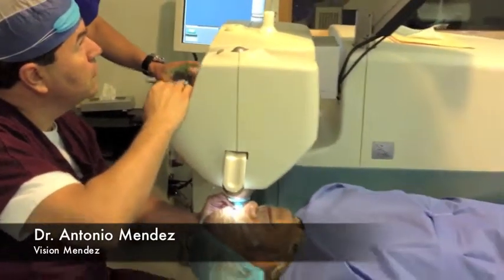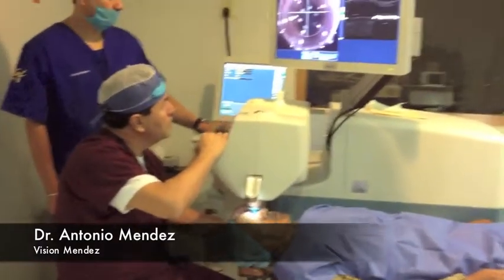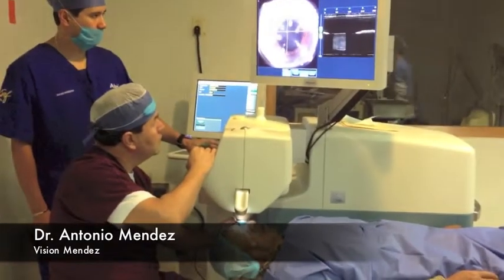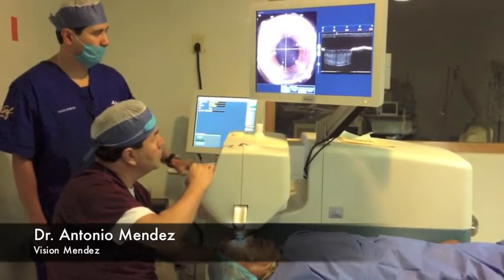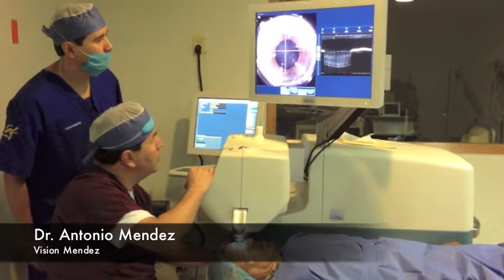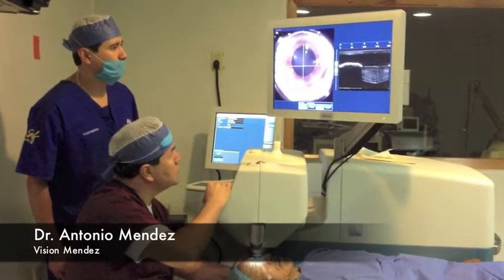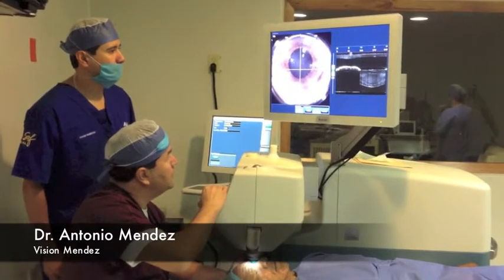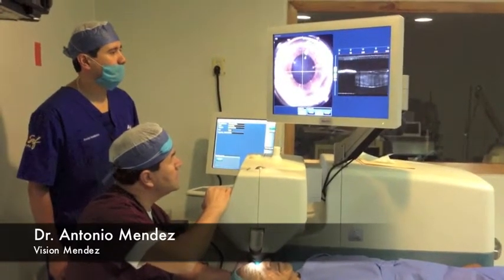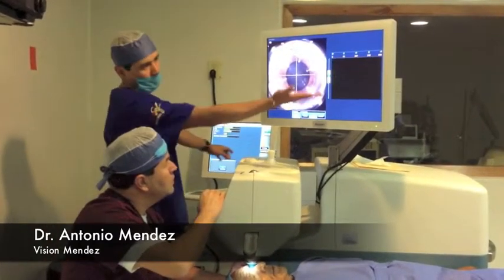We use a disposable single-use patient interface which touches and holds the eye in place. The procedure is painless and only feels some pressure for a few seconds. We use the monitor to guide the patient's interface over the eye. Once the eye and the laser are aligned, we can continue with the procedure.